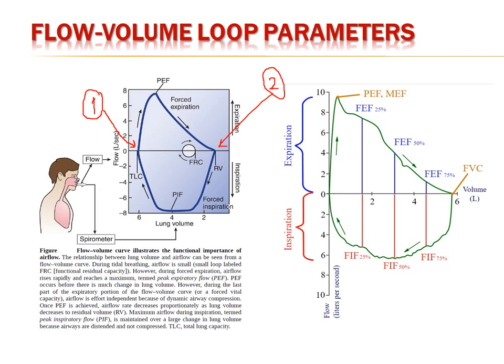I told you this point in the lectures, and as you can see here, there is no pointed peak in the inspiration.